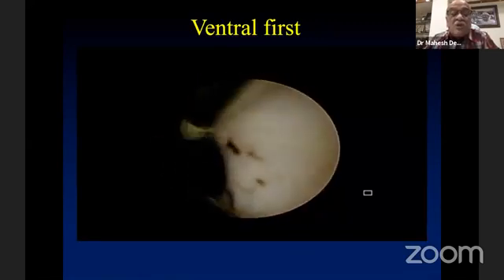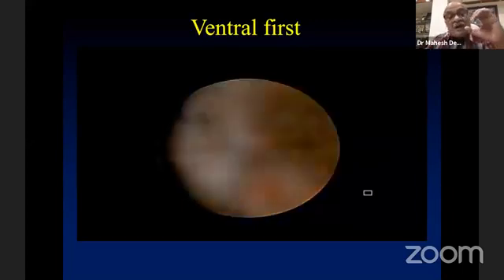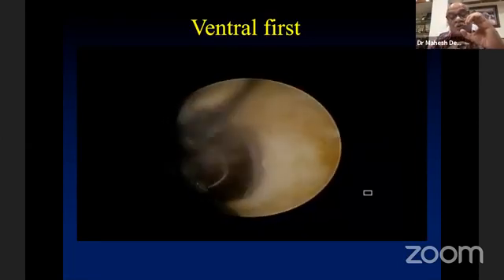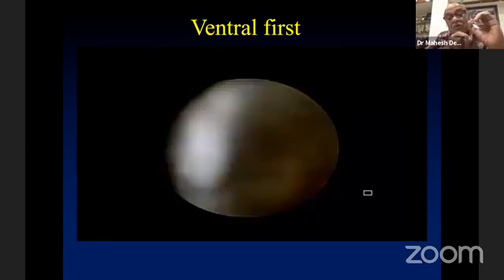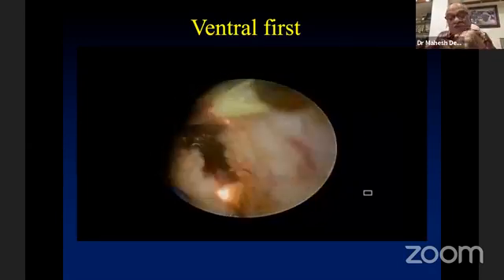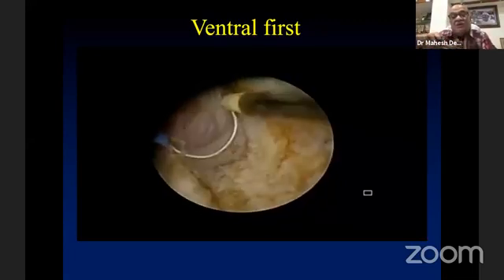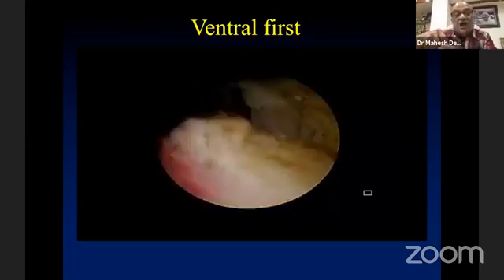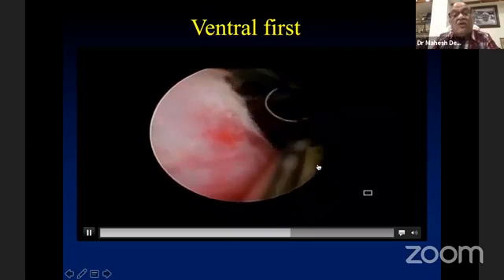One of the most important things is how you hold your resectoscope. You hold with the left hand the penis, and with the right hand you use the resectoscope. The moment you engage the tissue, you can put a little pressure on the tissue so it can go in. Then while you are coming out, you bring it out. So with the hand movement, you can adjust how much tissue you want to remove. Now this one lobe is dropped.